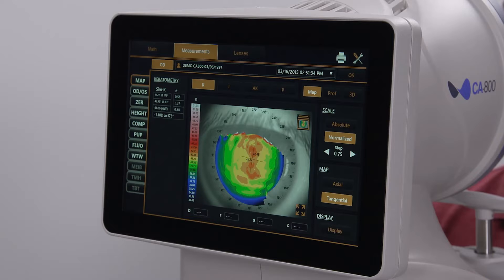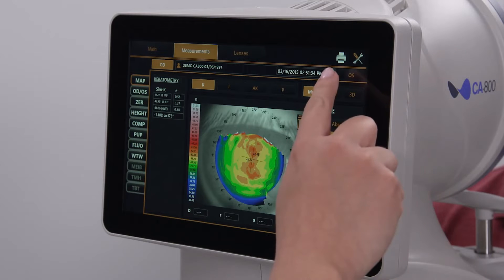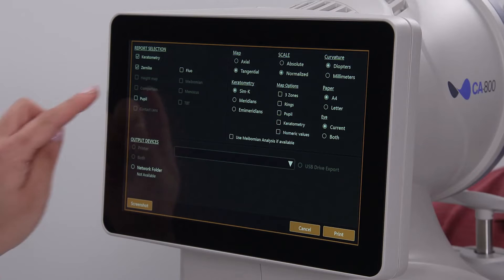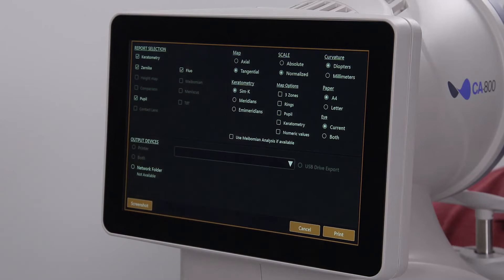To print or export a report, select the printer icon at the upper right. The reports available on the report selection page depend on the data acquired. Check the report or reports that you require. You can also choose how you want the measurements to be displayed on the report.